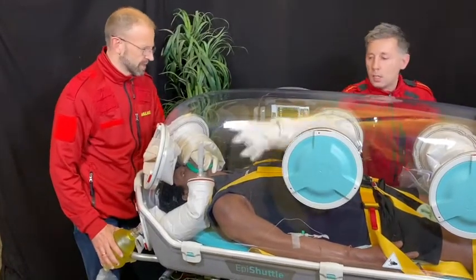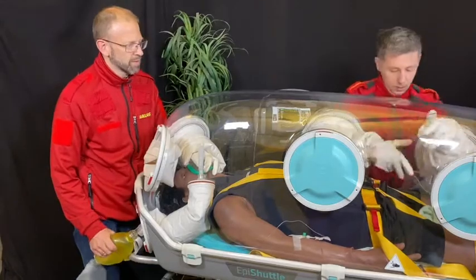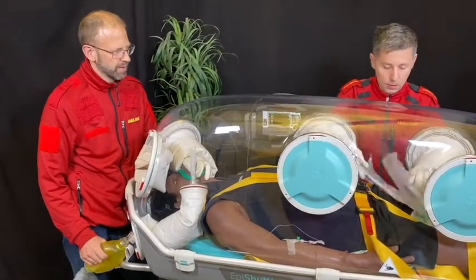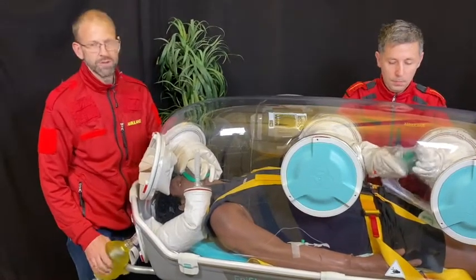And then we can start to get ready with the equipment. We have on beforehand placed the laryngoscope and the orotracheal tube into the EpiShuttle.